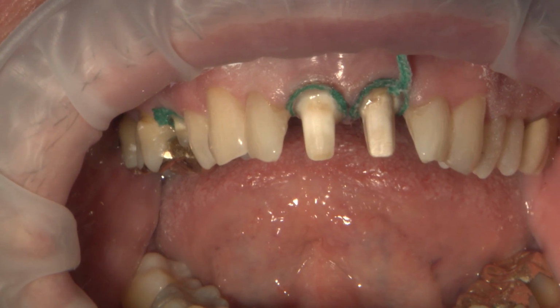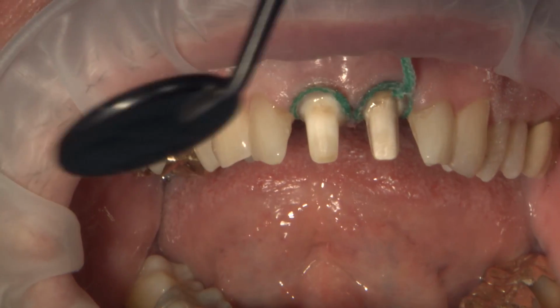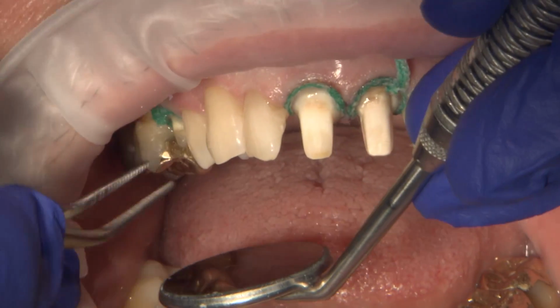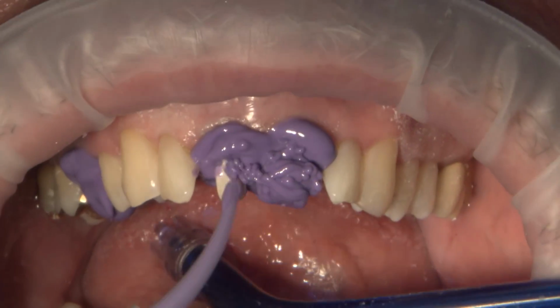Once the 5 minutes have elapsed, I'll remove the top cord and the top cord only, and verify that the smaller 000 cord stays in place. Sometimes the smaller cord can get dislodged slightly and move next to the margins. So if that happens, it's sometimes necessary to repack that first cord back into the sulcus.